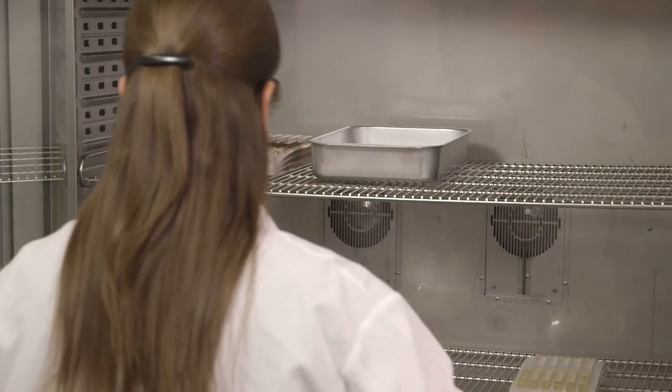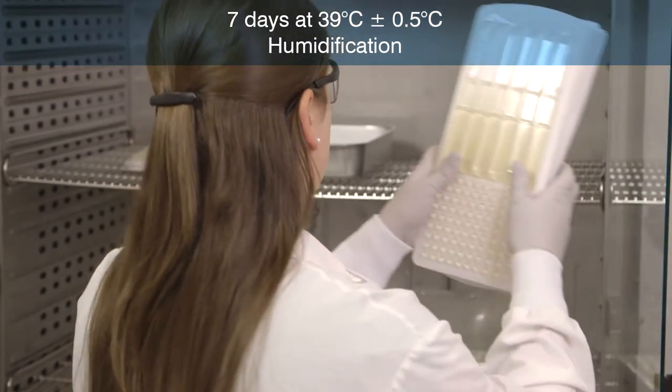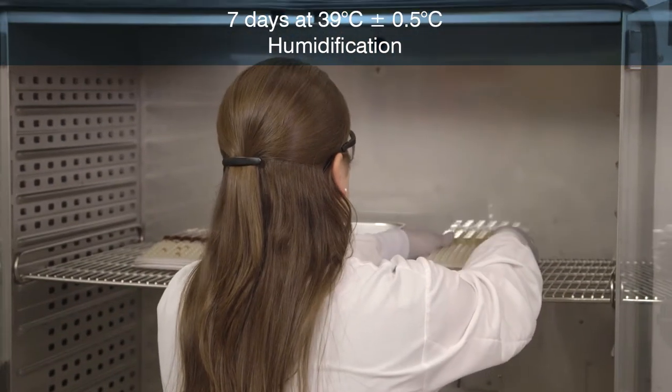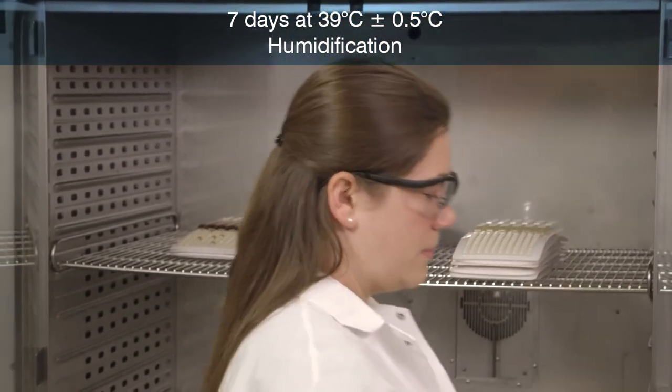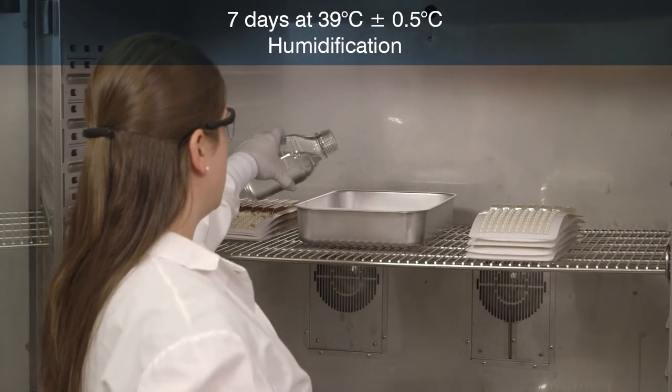Incubate the sealed tray, paper side down, for 7 days at 39 degrees centigrade, plus or minus 0.5 degrees centigrade. Alternate the trays top to bottom. To prevent trays from drying out, humidify the incubator.